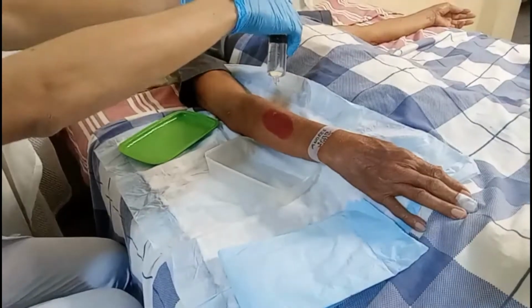Number 4, pinches the catheter below the syringe while in place. This is to control the direction of water from the syringe. Number 5, removes and refills syringe, reconnects to the catheter, repeats until solution drainage is clear. This is to ensure that unwanted material from the wound has been cleansed off.